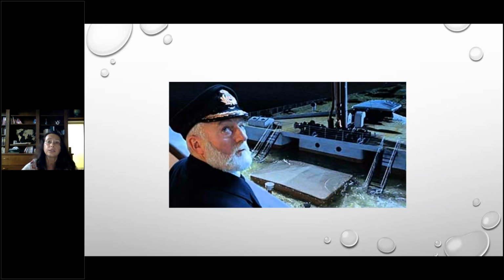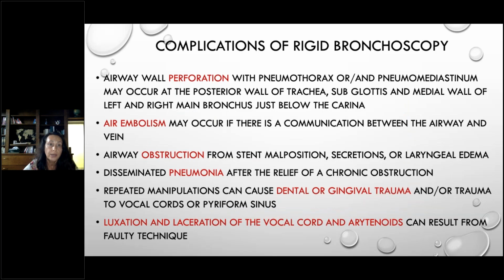So let's move a little bit to when we need a captain of the sinking ship. The complications of rigid bronchoscopy, which you're all very well aware of. I'm not going to talk about them. The reason why I'm listing them here is to underline the need for teamwork and for the anesthesiologist being aware of these possible complications, because most of the time we're the first ones to notice these complications and to alert you that they're happening.